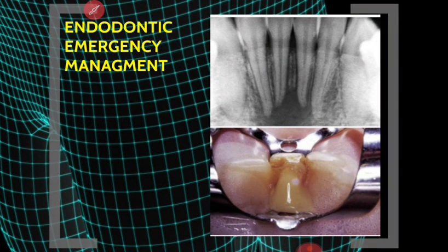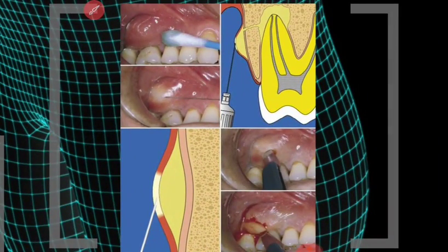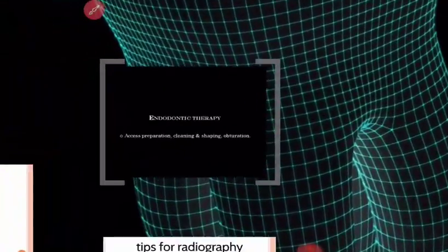And though that was about pain and referred pain, sometimes there will be endodontic emergencies in your clinic, like pus collection and a sinus. You don't always have to do incision and drainage. You can just open the tooth, take a sterile file, 1 mm beyond the apex, like 15, 20, 25 or 35 if the apex is wide, and create a path for the pus to drain. That's an emergency treatment, and if the pus drains, the patient will have relief. On the other hand, if it is a pulpitis pain and the patient is having severe pain, you have to remove the pulp. So this is about incision and drainage, which I don't do much.